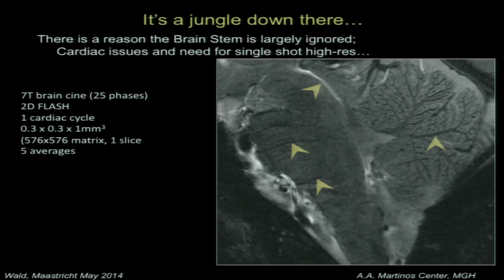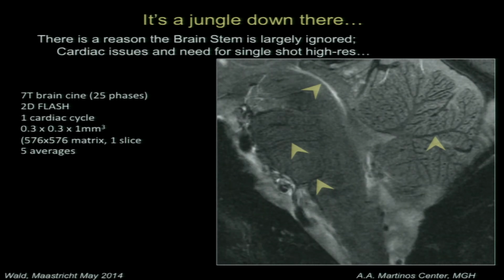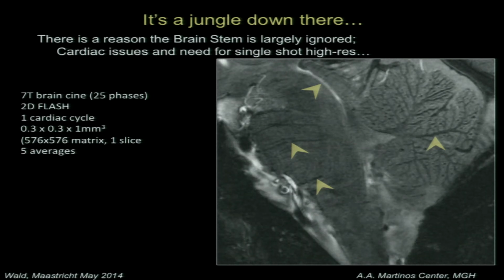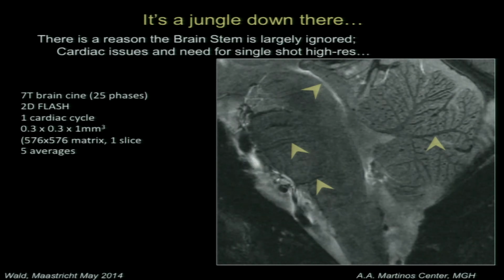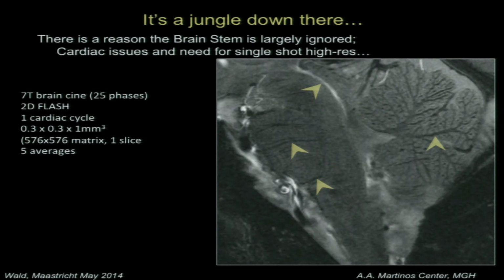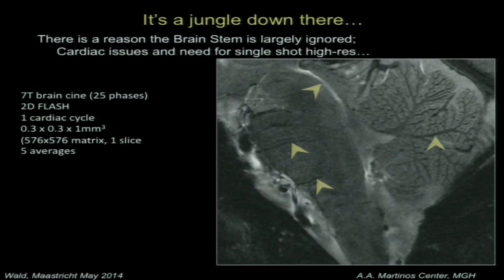And it's funny, if you stare at this image for about 5 minutes, you appreciate that there are waves of intensity variation going through it. And there are waves of spatially modulated intensity variation, but there's very little motion. We simply don't see that 1-2 millimeters of motion that these earlier papers showed.